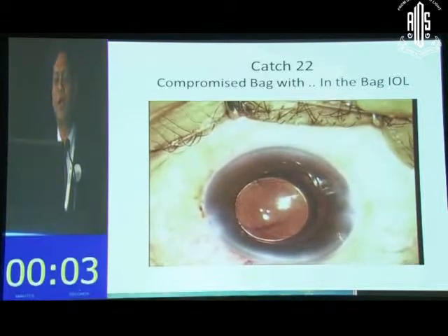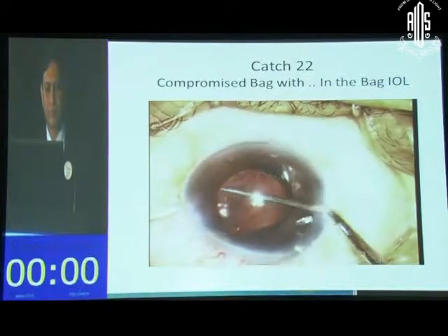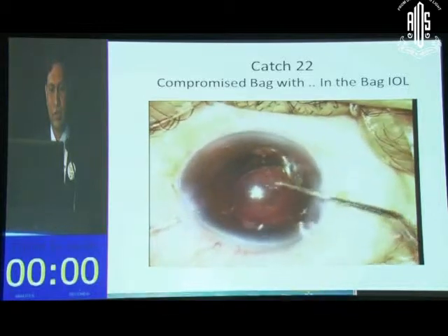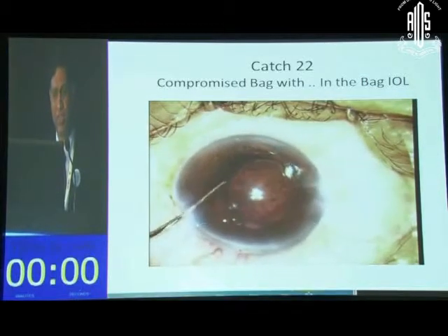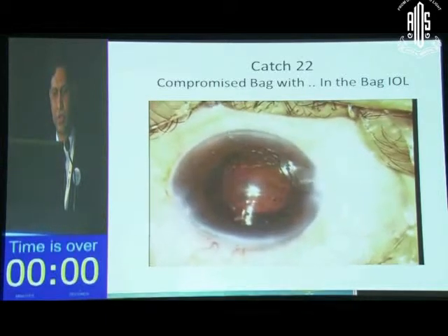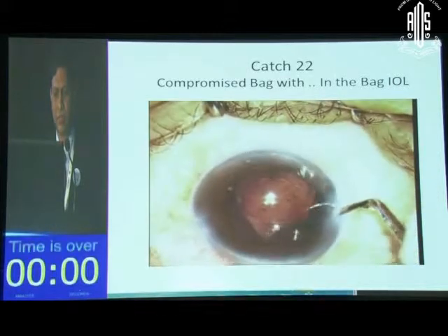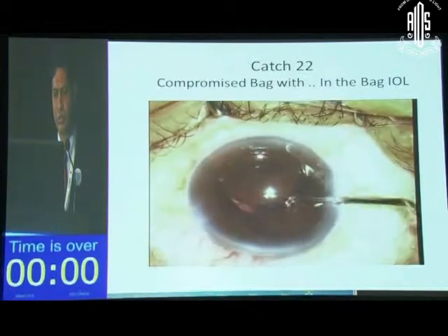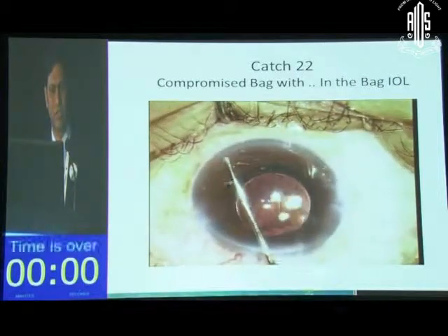So I had to anteriorize the entire lens and bring the haptics into the anterior chamber. There I am. I really didn't want to mess up my capsule rhexis, but these lenses are very good. The rhexis also is very forgiving. Once I had one haptic out into the anterior chamber, we get the other haptic out. This is a very good device, a reverse Sinskey. I think they use it for Descemet scoring. So there I had both the haptics in the anterior chamber. This is the only way you can tuck those haptics into the sulcus, the only way.